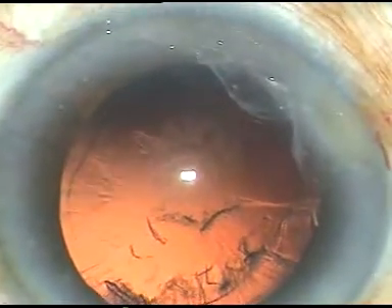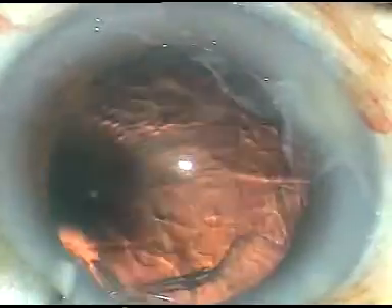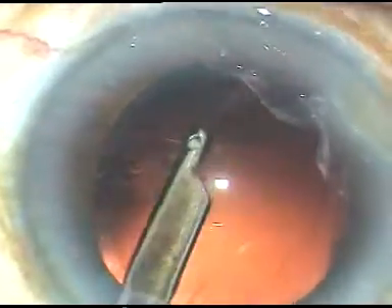If you do this, you will never cause any complication in soft cataracts. It is much, much safer than the divide and conquer technique in soft cataracts. Please don't try to trench in soft cataracts. While trenching itself, as you go deep, you can pierce through the posterior capsule by the phaco tip, and you can cause a rupture just in front of the center of the posterior capsule.